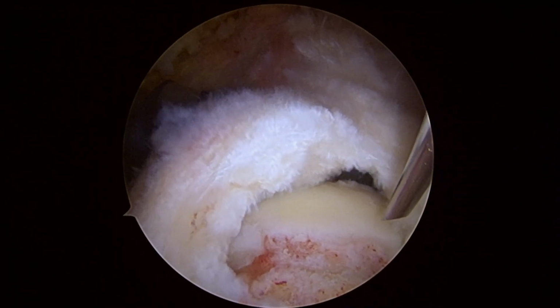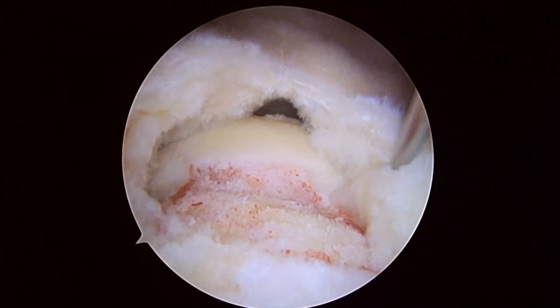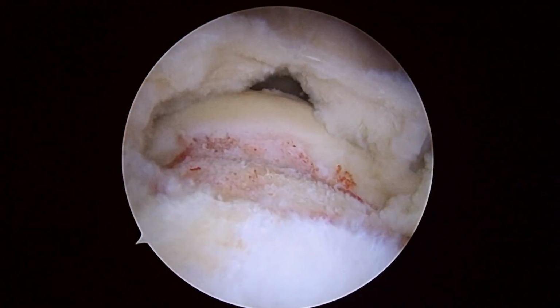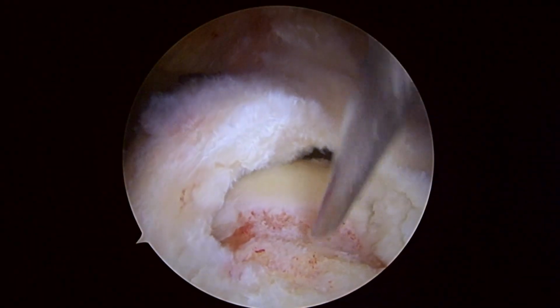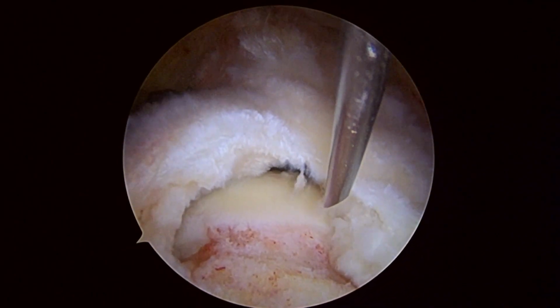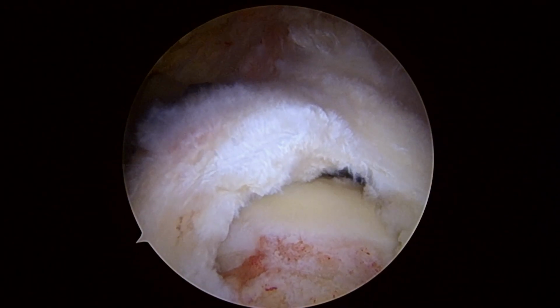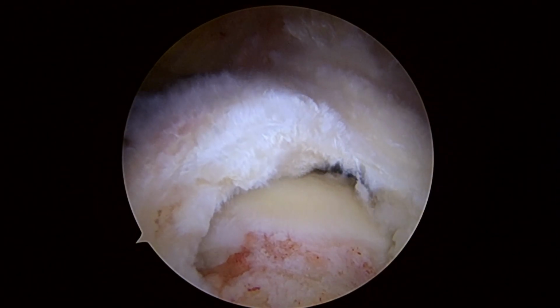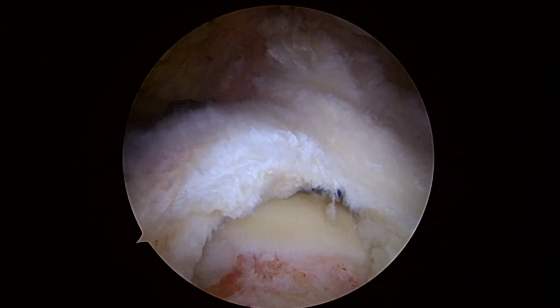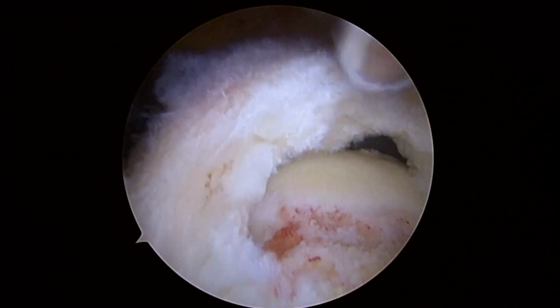Okay, so here's the tear. We've got a needle in just to plan our anchor placement, and things are looking pretty straightforward. I think if we place one anchor here, we'll be able to get this fixed for you. We'll go ahead and make a little nick in the skin, and then through that little nick, we place our guide for the anchor. There's the guide coming down.